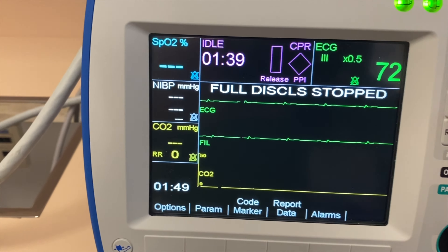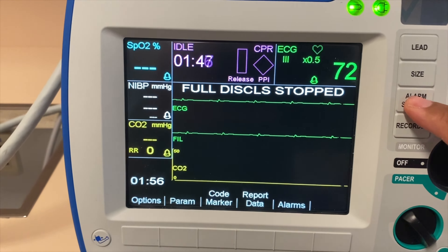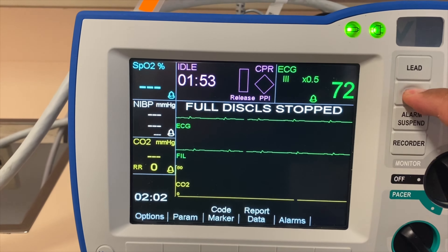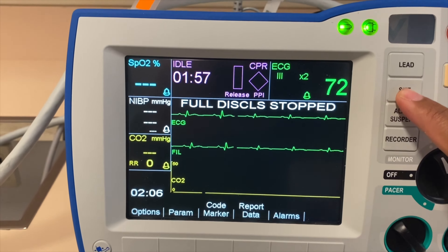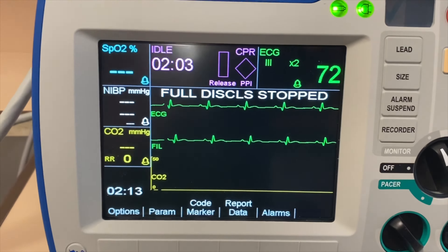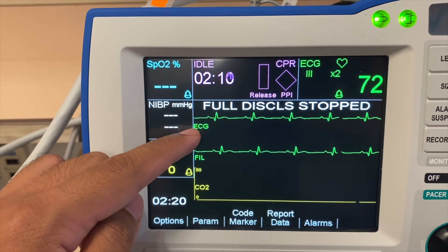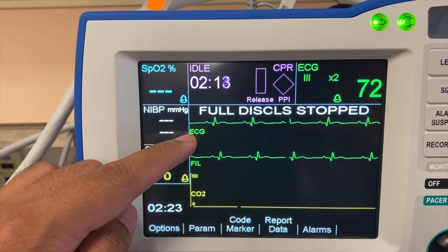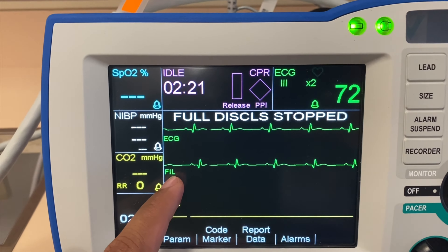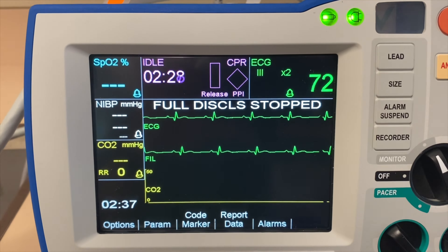Note that right now the alarms are suspended, as shown by the bells having an X mark. Now I have turned the alarm on. If I want to increase the size of the display, I can do that as well. One good feature of this Zoll defibrillator is that this ECG gets affected with a lot of movement, especially when you're doing CPR — that's where all your artifact is going to show. In this filter area, this will actually let you see the underlying rhythm; it filters everything out, including all those artifacts. That's a good feature of this machine.